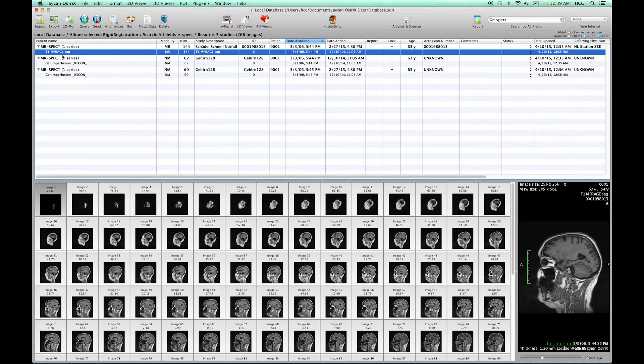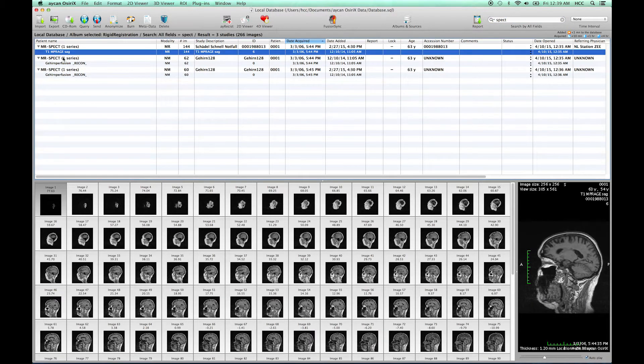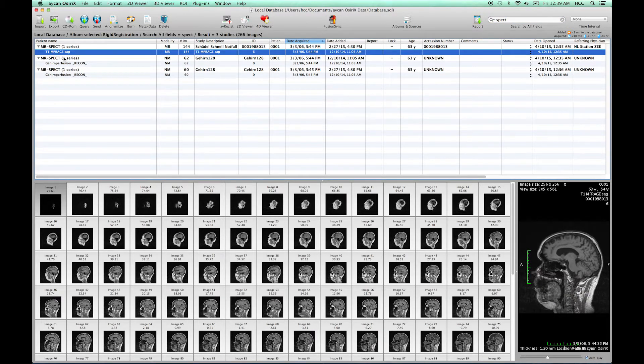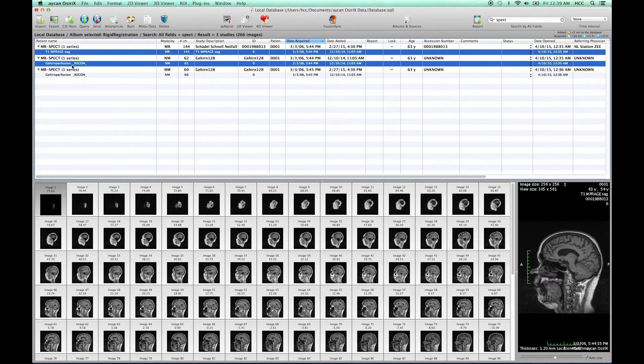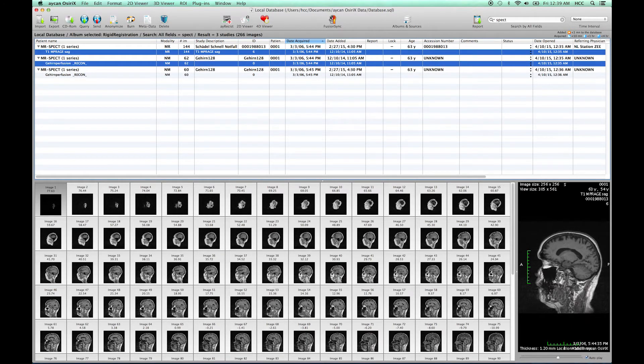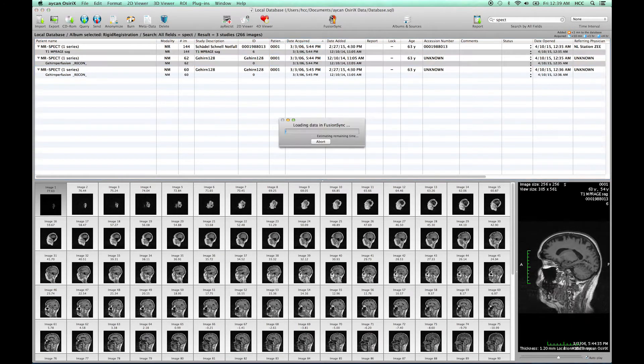Here I select the MR scan together with the first SPECT image by holding the command key while clicking. Then we start FusionSync.